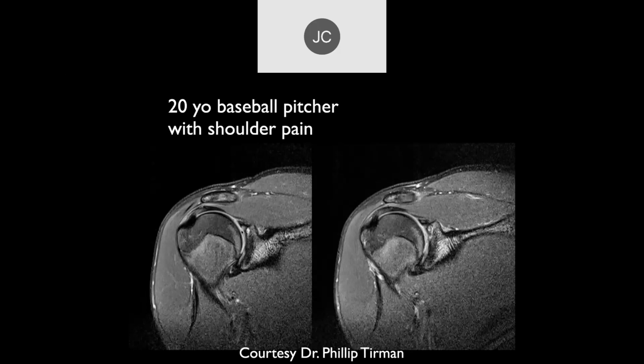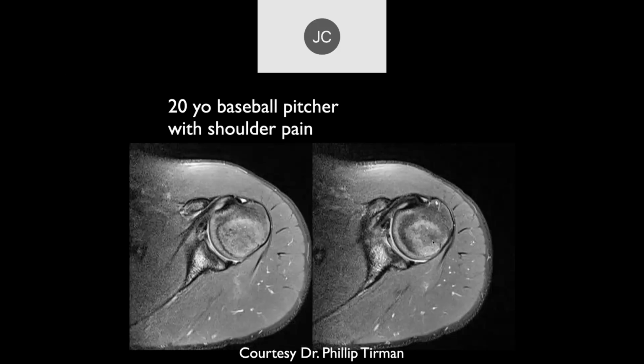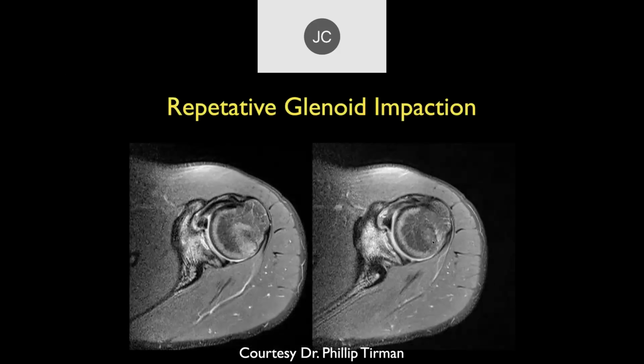I'm not sure. Is there a little bit of edema there at some glenoid, maybe subchondral, maybe some edema there. There are other areas of the bone that you can injure by chronic repetitive trauma as well, and this is due to repetitive glenoid impaction. Okay. So it's another young person's injury, but this would not be called little league shoulder.